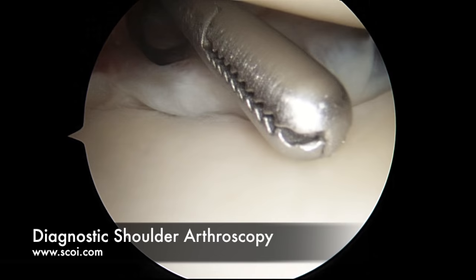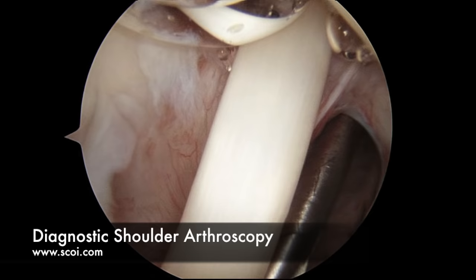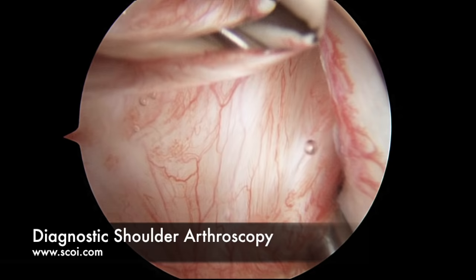This structure right here is the first step in our diagnostic arthroscopy, which is the long head of the biceps tendon. We can pull that down and into the shoulder and take a picture of that. It looks quite good — there's no signs of significant damage. There's a little bit of redness on the top side, a little bit of inflammation.